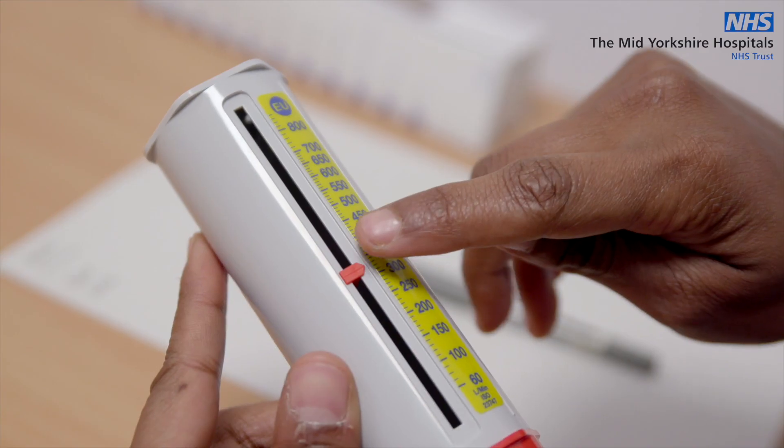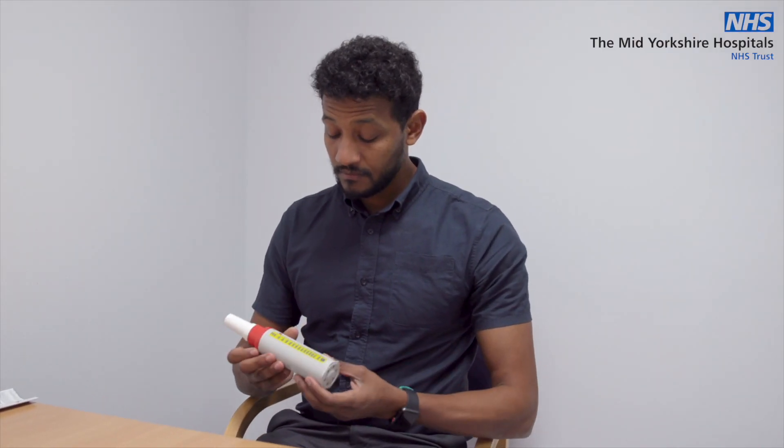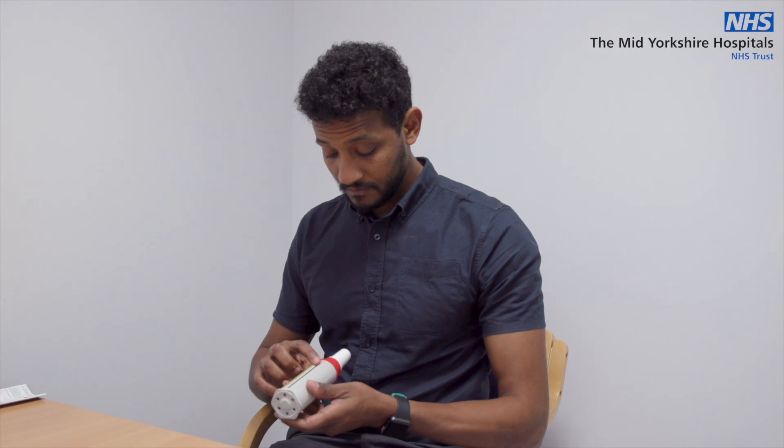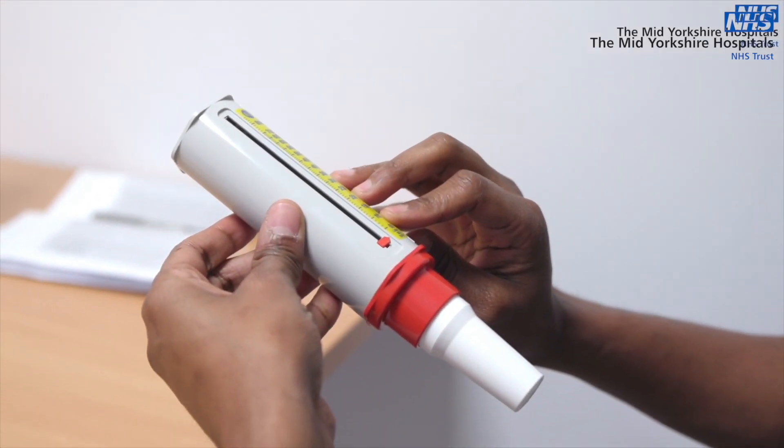First, make sure the little arrow is set to zero at the bottom of the meter near the mouthpiece. Either choose to stand or sit upright each time you do the test, but do the same each time. Hold the peak flow in both hands, but make sure your fingers are not over the middle.